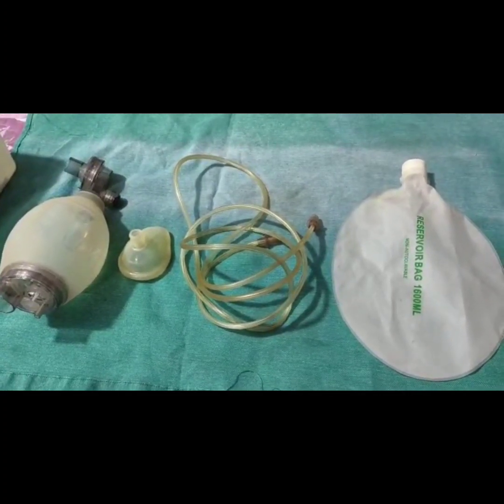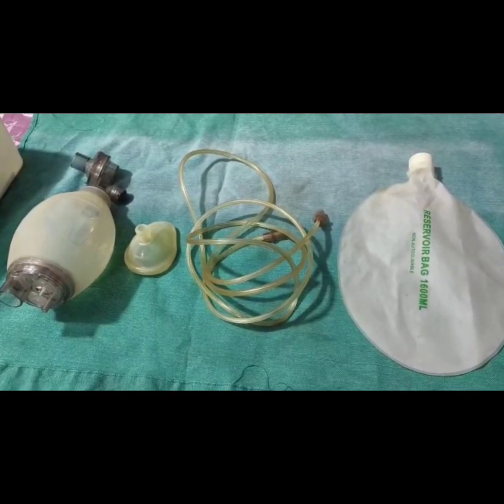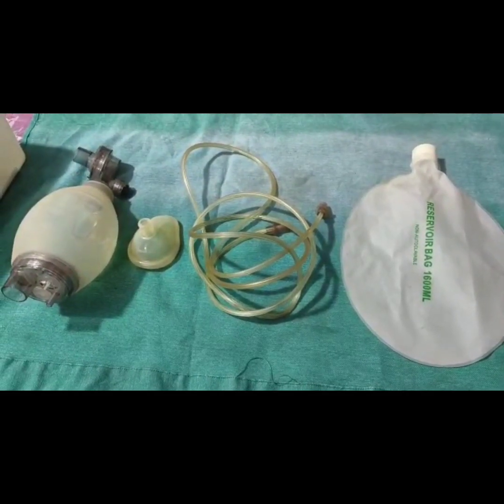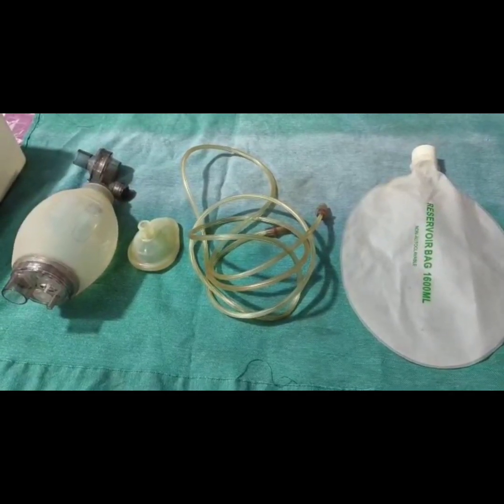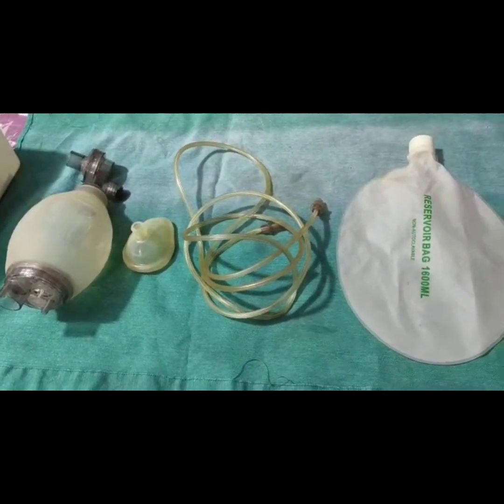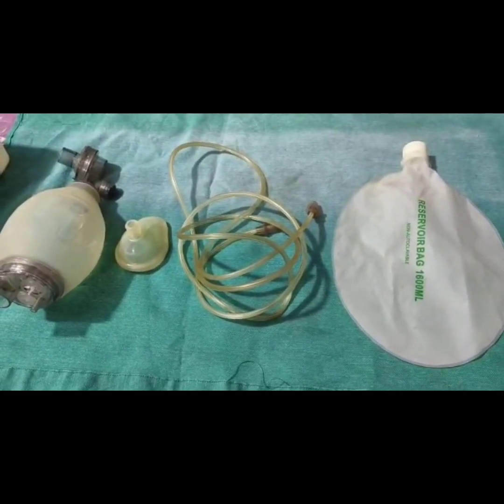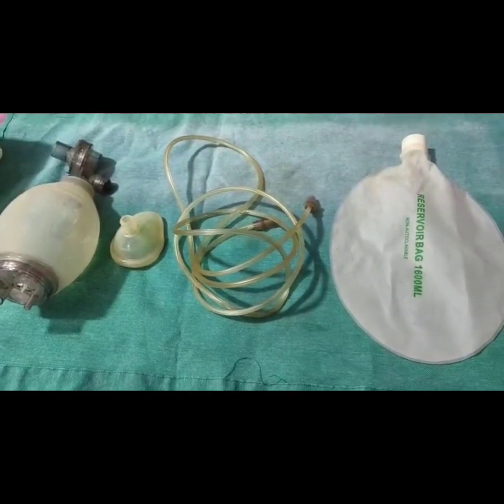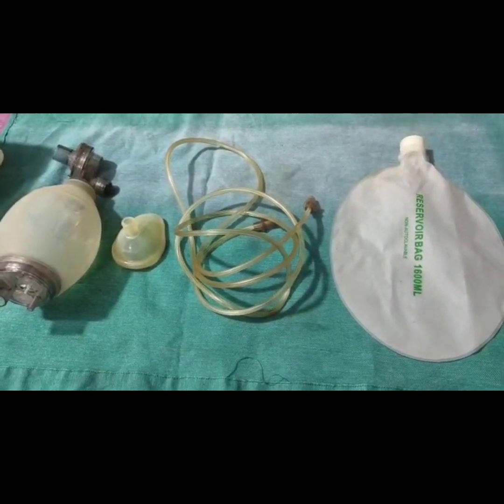The full form of Ambu Bag is Ambulatory Manual Breathing Unit. It is also called a Self-Inflating Bag. There is also a Non-Self-Inflating Bag — the example of which is the Anesthesia Bag. You must have seen it in OT theatres: a green colour bag which needs a continuous flow of oxygen to pass oxygen to the baby.